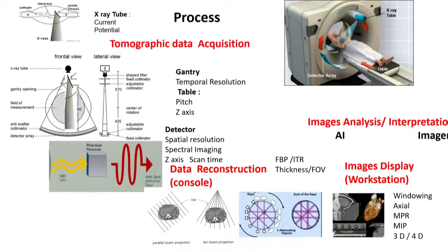Okay, so what is the general process to getting a CT image? So this is very basic for any CT, okay? First, we need an X-ray tube to generate electrons and then photons. So different from nuclear. Nuclear is emission, SPECT is emission tomography, correct? Because we inject a radiotracer and the patient's heart is the one sending the signal.